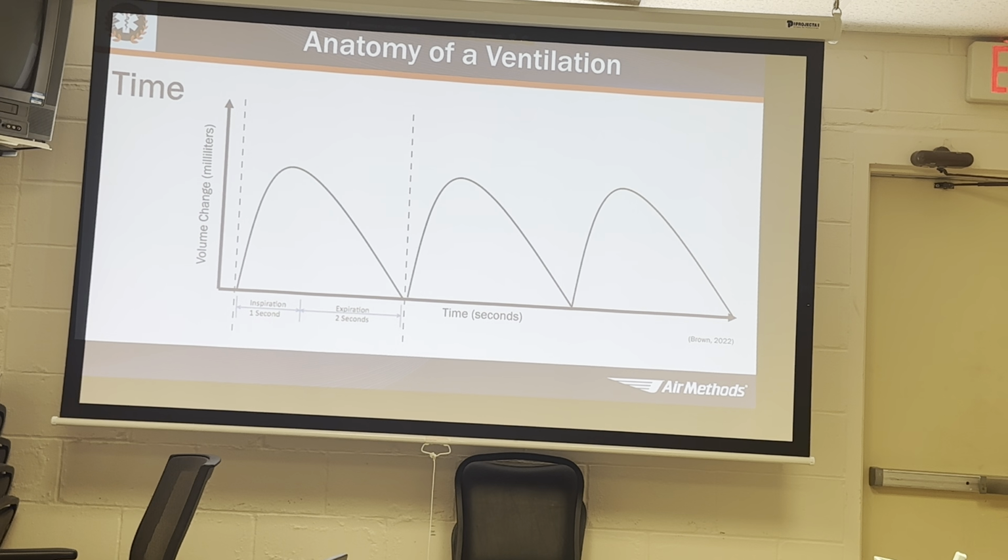So yeah, and then this talks about the anatomy and physiology of I:E ratios, and this is something I think we always forget about when we start bagging our patients. We're just squeezing the whole bag, right? In most Ambu bags there's about 1,000 mLs of volume that we can give through that, and we squeeze it a whole lot, so we wipe out this I:E ratio. Naturally, we all breathe in and then we breathe out, so we spend 2 times as long expiring that air as we do inspiring it. So we want to maintain an appropriate I:E ratio.